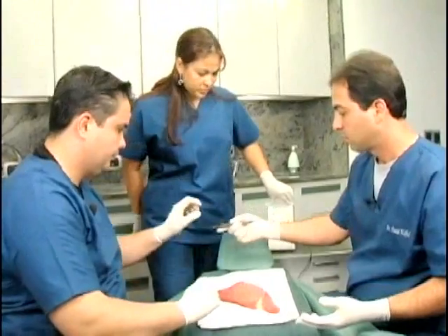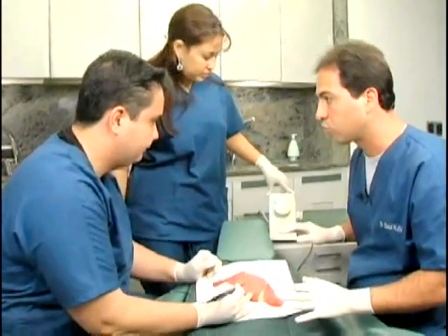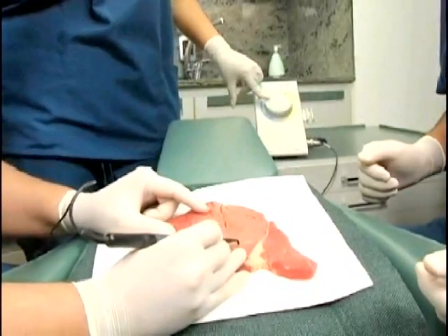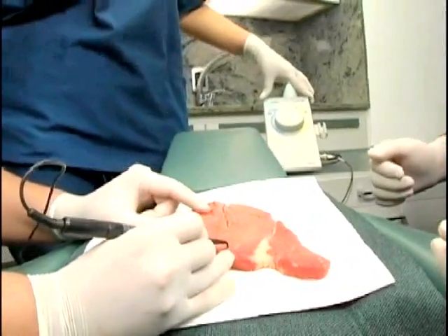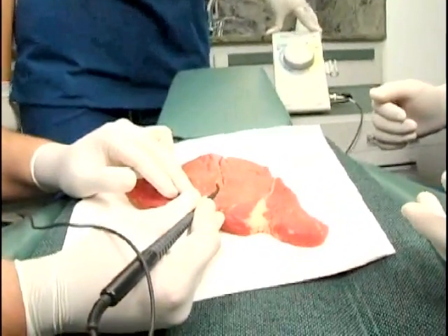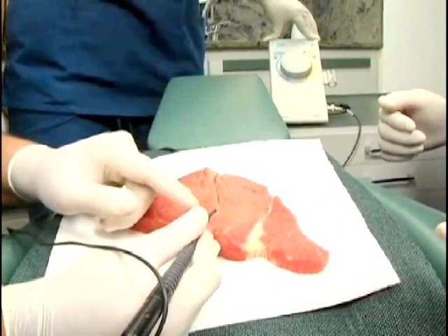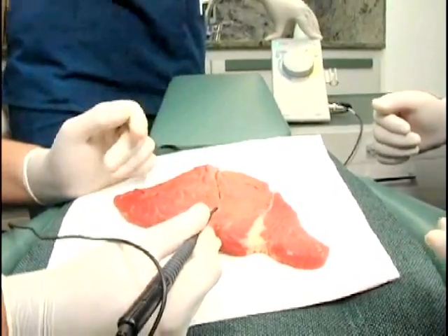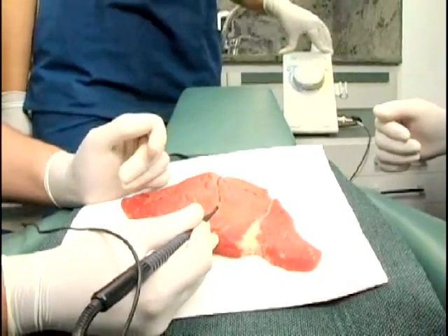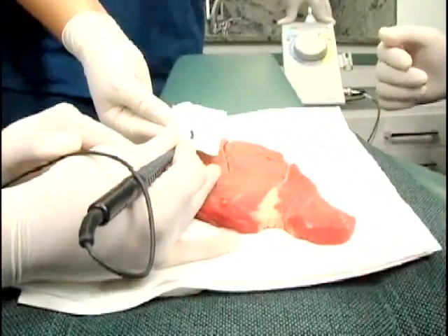Now let's do the cut, but this time the power is turned to a very low setting. You can see that when the power is too low, the electrode encounters resistance and tissue shreds adhere to it — it does not cut at all. When tissue shreds adhere to the electrode tip, wipe the tip with a soft alcohol-soaked cloth.